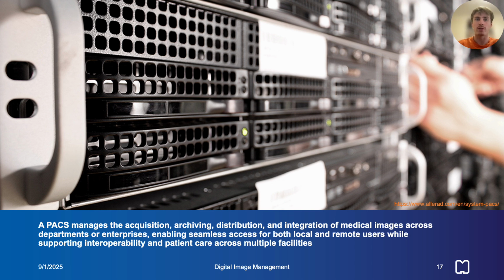A PACS is responsible not only for acquisition, archiving, and distribution, but also management of the workflow and integration with other departmental-wide information systems, such as the Radiology Information System. PACS may also be linked to electronic medical records systems that provides access to a broader range of information about a patient in one facility, or to a longitudinal patient health record system that provides for information to span facilities.